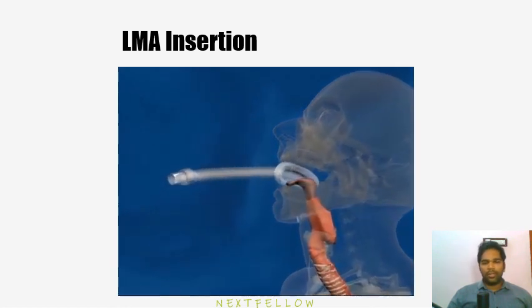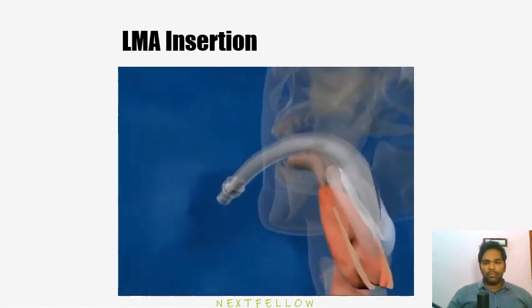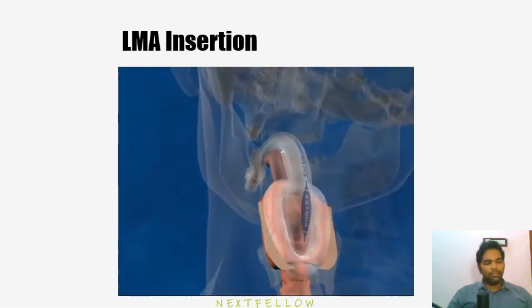Once again, they are showing the same thing. When the tube is inserted fully into the hypopharyngeal region and the tip of the cuff rests on the upper esophageal margins, this causes air to be displaced within the cuff and assists in creating a seal.